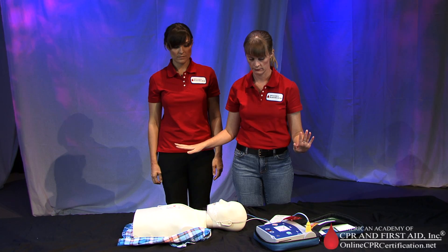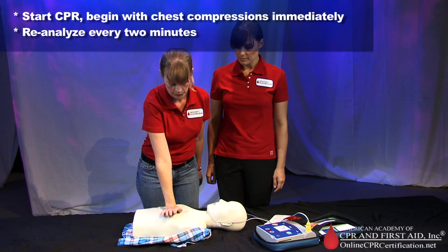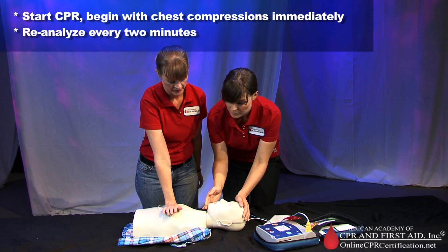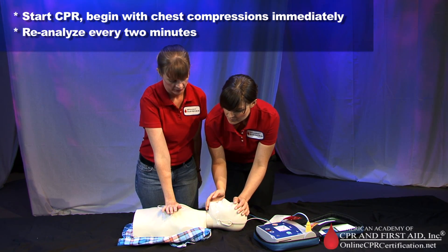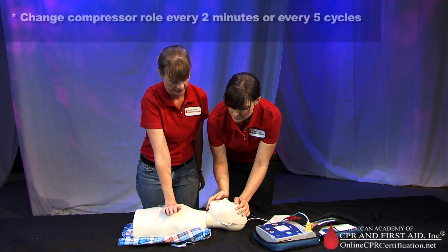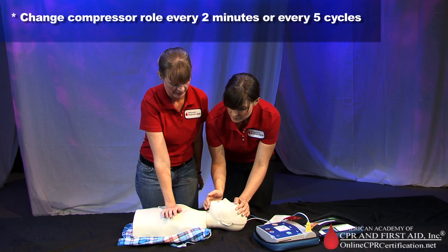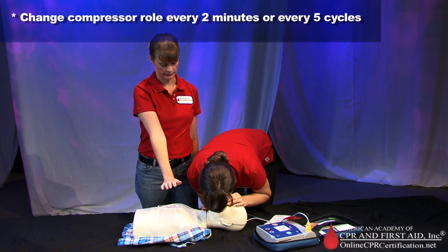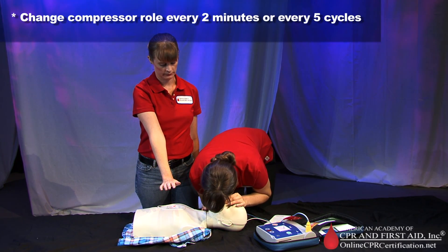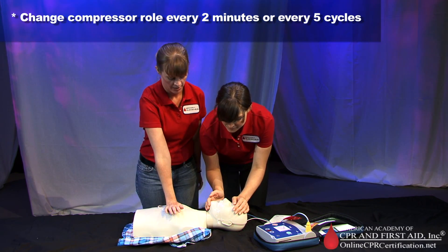Begin CPR. Rescuers should continue CPR beginning with chest compressions and reanalyze every two minutes. Two or more rescuers should change the compressor role approximately every two minutes to prevent compressor fatigue and deterioration in quality and rate of chest compressions. Rescuers should try to change the compressor role in less than five seconds.